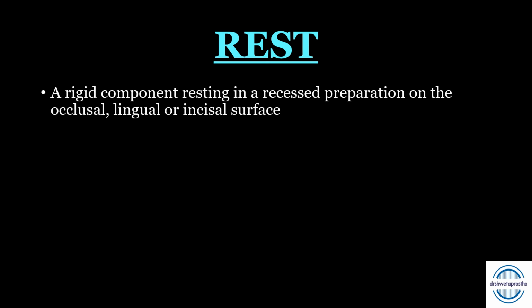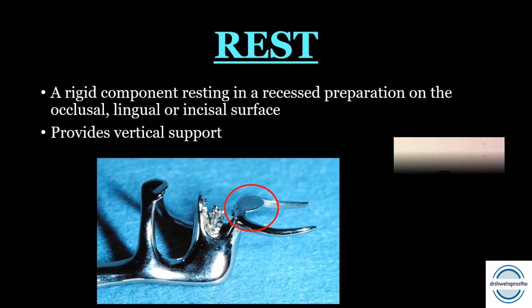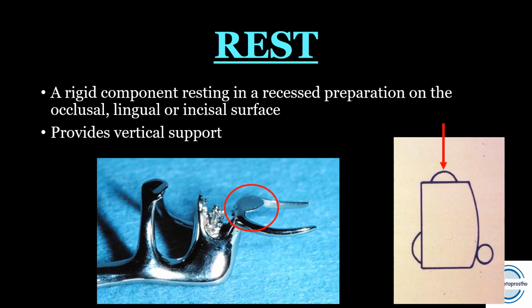The next part is rest. Rest is a rigid component resting in a recessed preparation on the occlusal, lingual or the incisal surface. Its main function is that it provides the vertical support.